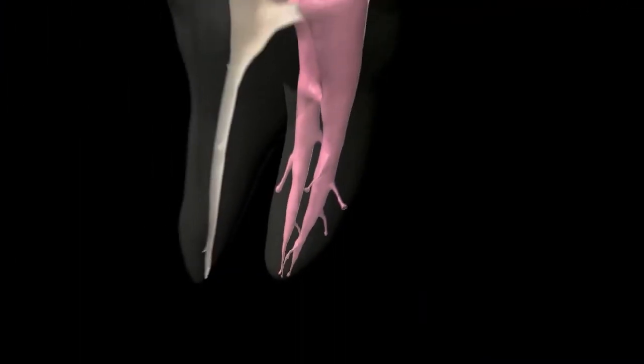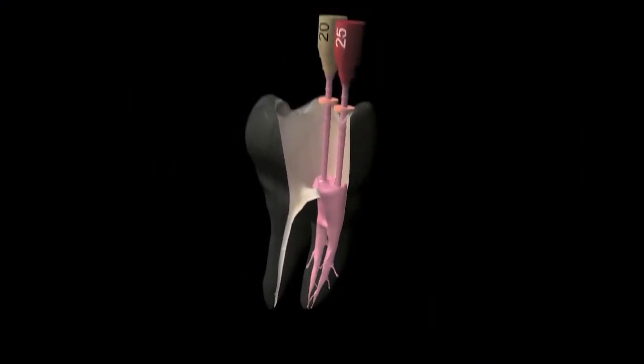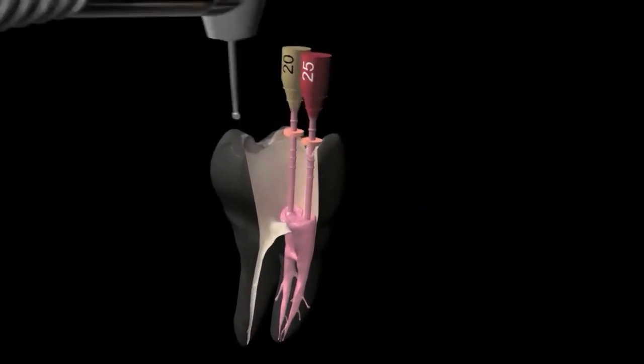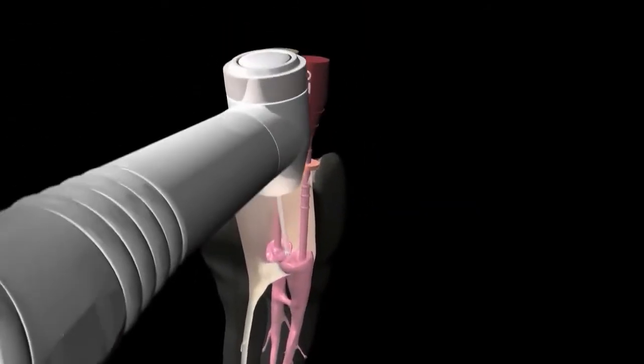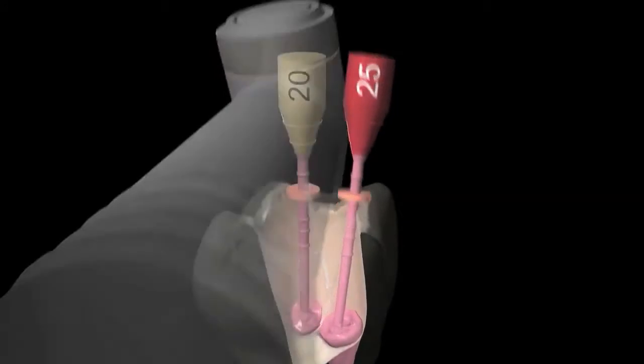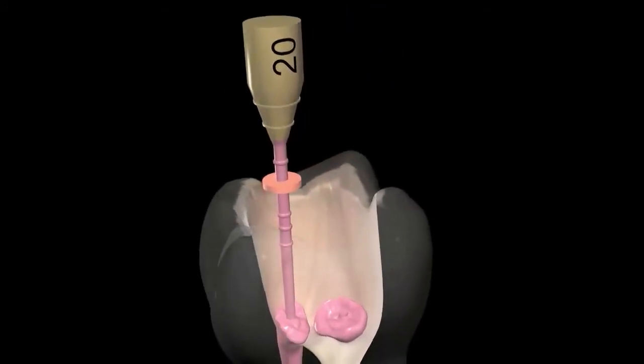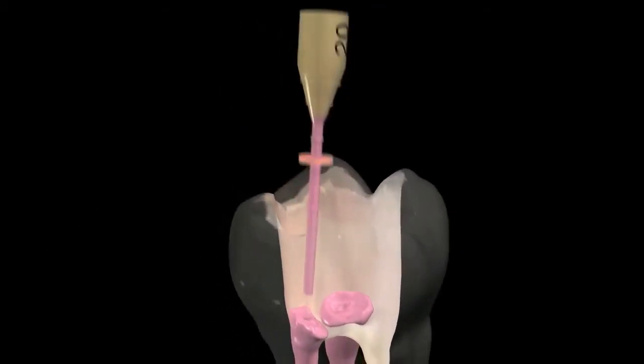When gutta-core reaches its working length, use a round burr to sever the obturator at the canal orifice. You can also remove it by bending from side to side without impacting the seal.